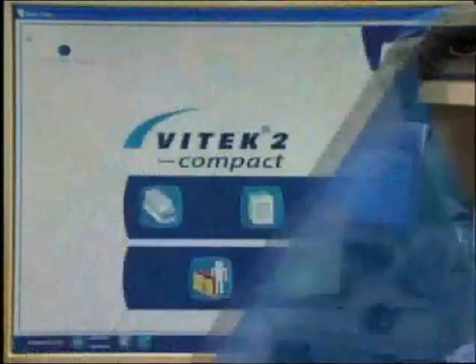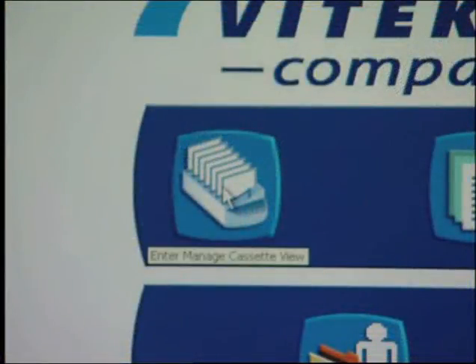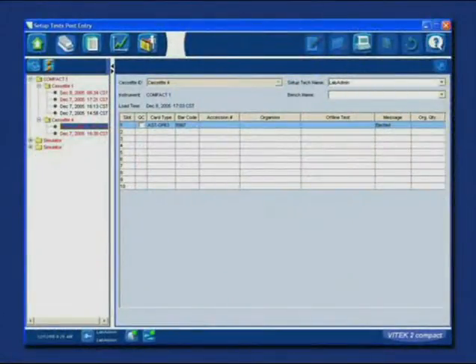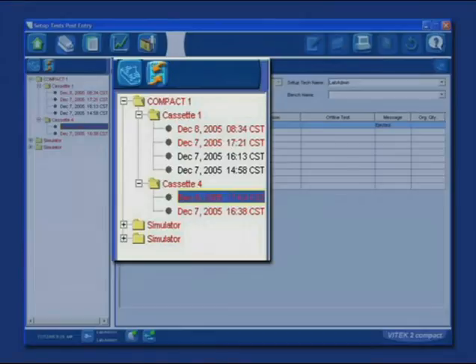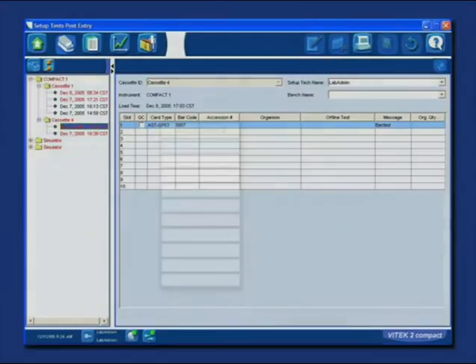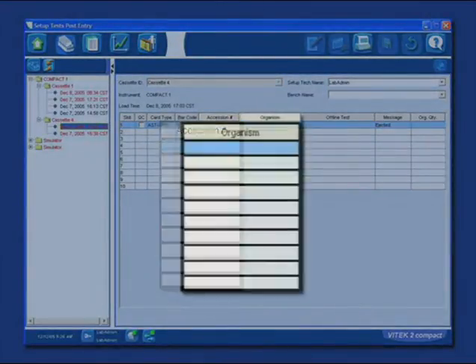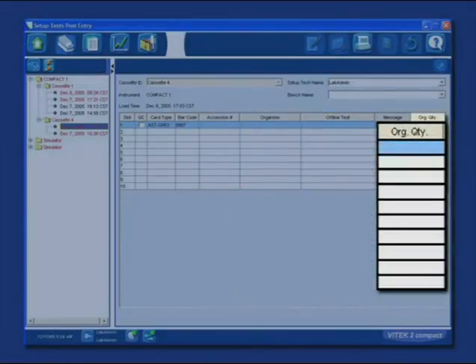Log in if necessary. Select the Enter Manage Cassette icon. In the navigation tree, cassettes that need information appear in red. Expand a cassette to see the date and time it was loaded, then select the cassette you loaded. The information read by the instrument from the cassette and test card barcodes appears. Fields for accession number, organism name, offline tests, and organism quantity are blank.